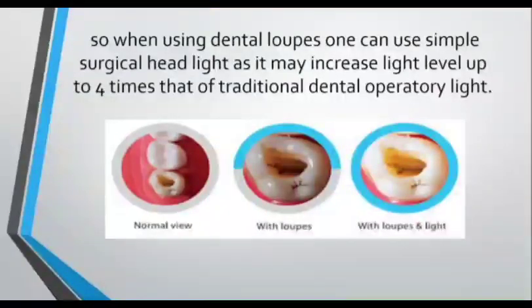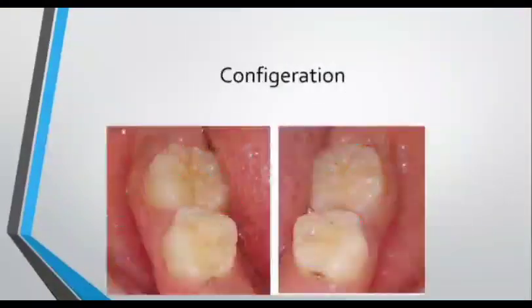So when using dental loupes, one can use a simple surgical headlight, as it may increase the light level up to 4 times that of the traditional dental operatory light. So in brief, in order to become excellent in endodontics, magnification is essential.